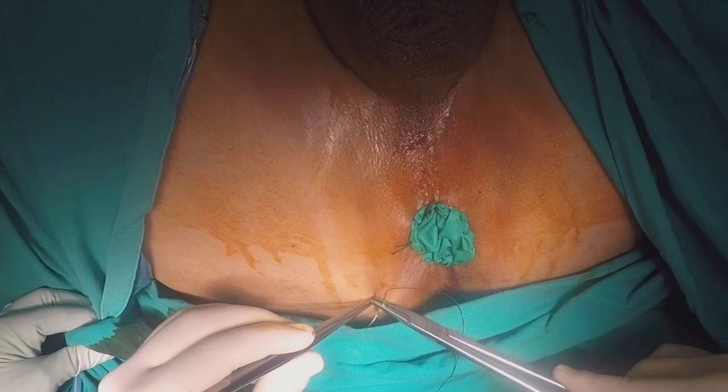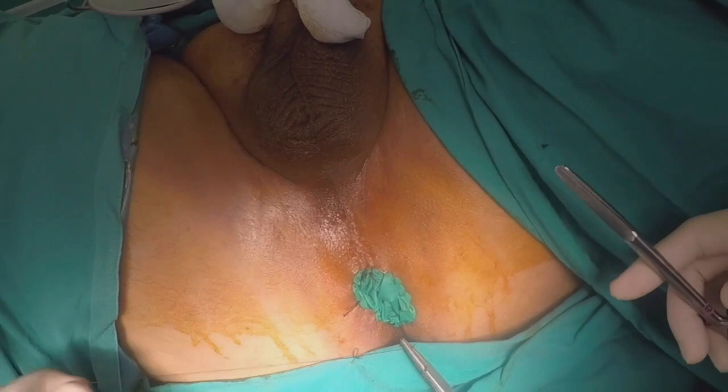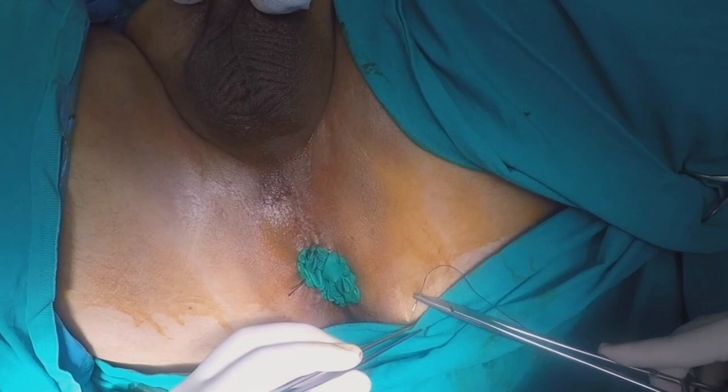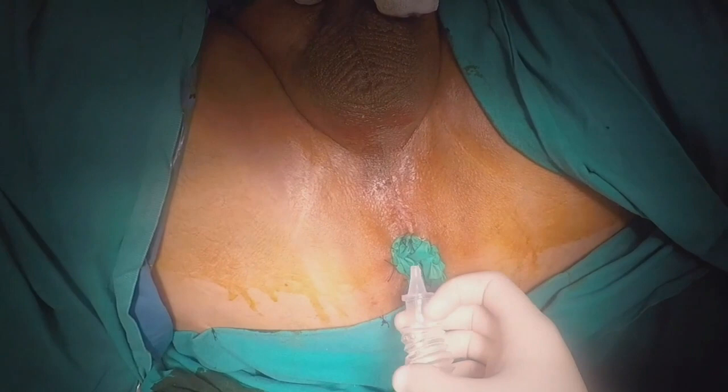Okay. And you have patient selection for these cases. What kind of patient do you choose for this kind of approach? First cases, we select patients with colon surgery or bowel surgery before, and kidney transplantation before the prostate cancer. So we select, but nowadays, when we have experience, the result is good. The organ limited prostate cancer patients, we perform. Localized? Yes. Ah, okay.